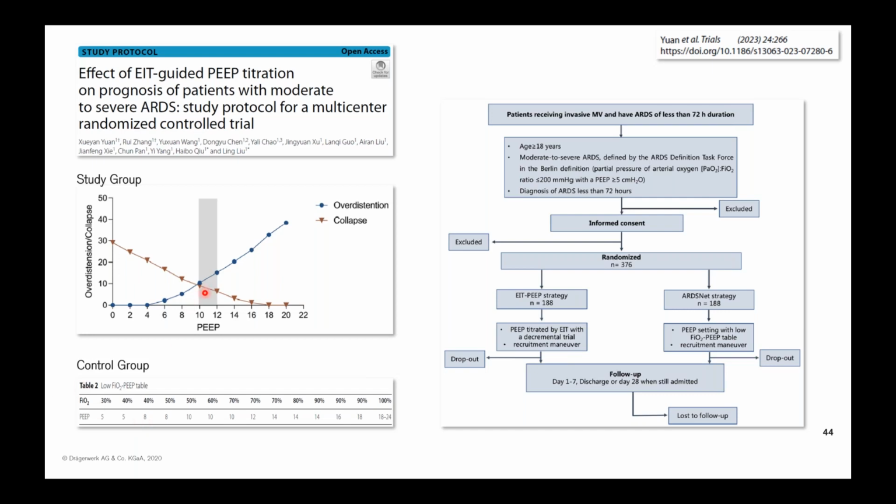Again, the PEEP optimization based on EIT will be done based on this crossing point in the tracings of the overdistension and collapse.